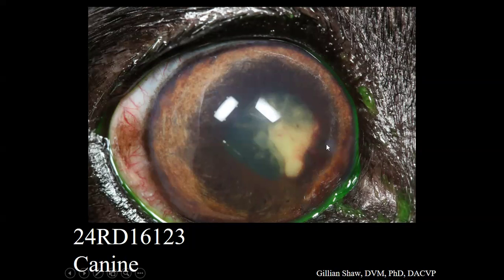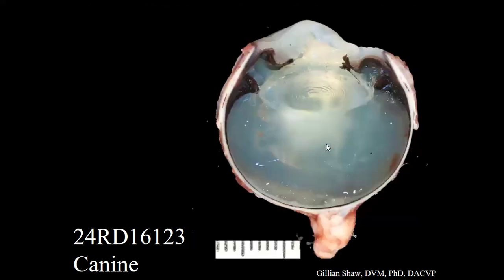And so I actually spoke to this clinician beforehand, and there was concern for an infectious organism. And so I made sure to request that whoever grossed this globe took a picture of it grossly. So we got a nice picture of it.